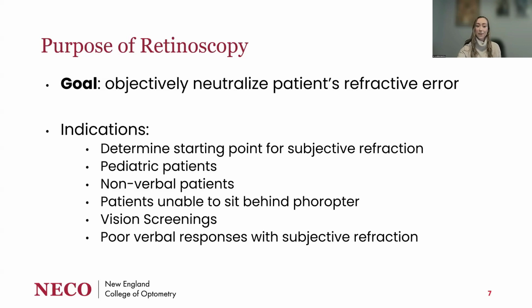Retinoscopy is also great for vision screenings when we're not able to roll in the entire phoropter, and just to get an estimate of prescriptions and whether they should be referred for further eye evaluation.